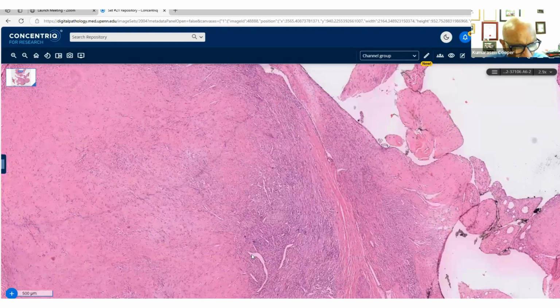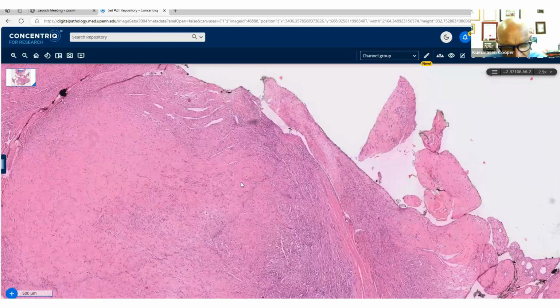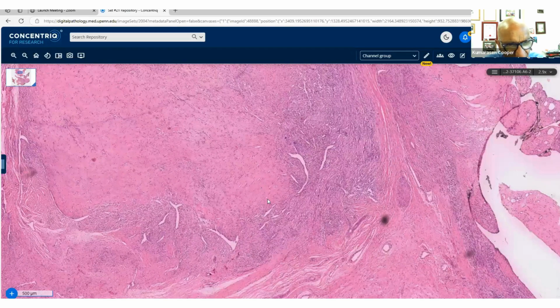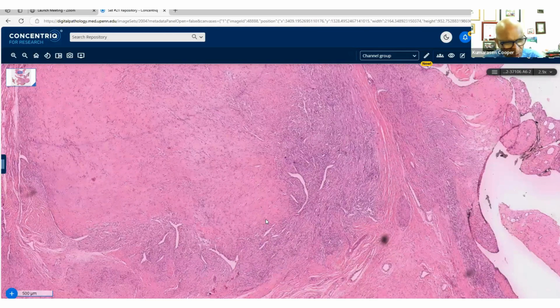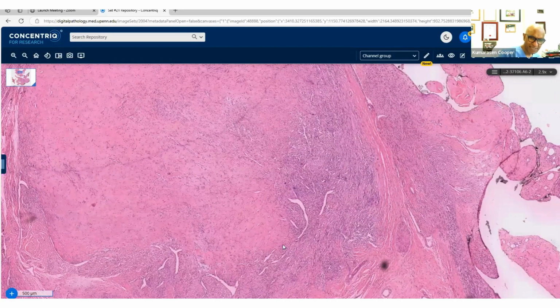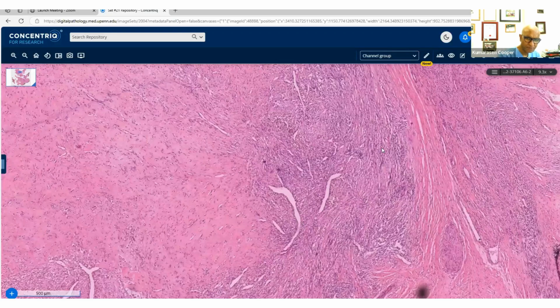You mentioned myopericytoma. Let's broaden that, and perhaps think about that as a perivascular myoid tumor. The perivascular myoid tumors, of which myopericytoma is one, can have staghorn vasculature. Typically, the myopericytoma has onion skinning, where the spindle cells form an onion skinning appearance around the vessels. This doesn't quite have that pattern.